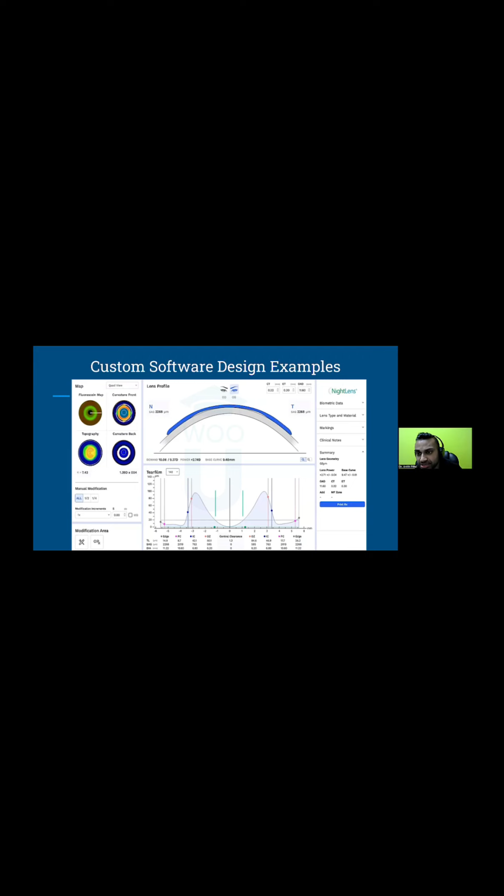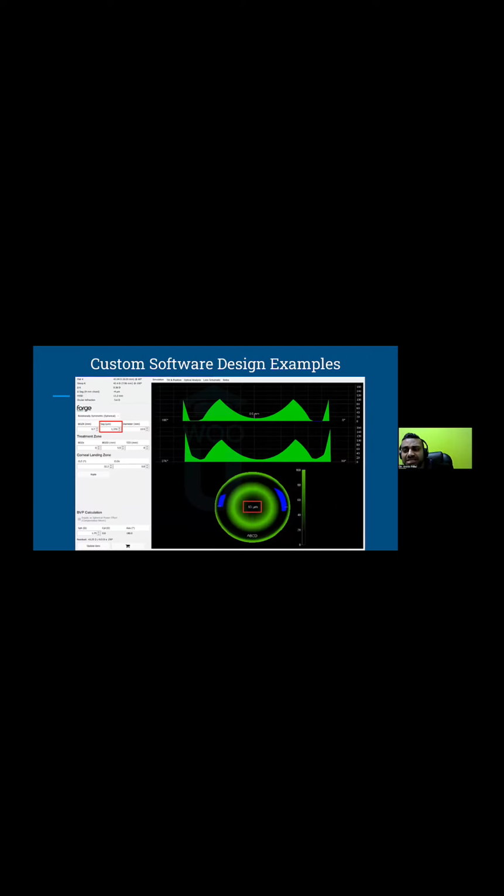And each company is going to be a little bit different. So here's another design example, a little bit different, where you have the actual tear film analysis on top and then a fluorescein pattern on the bottom. So again, you're going to be typing in a refraction, HVID. You can have the software just import it from your topographer if you like, or manually measure it. I actually would recommend manually measuring it off of either a slit lamp, or if you have a Scheimpflug image system, maybe measuring off of that. But once you put that data in, it's going to spit something out, and you'll have this initial tear film analysis. And then you start to really work.